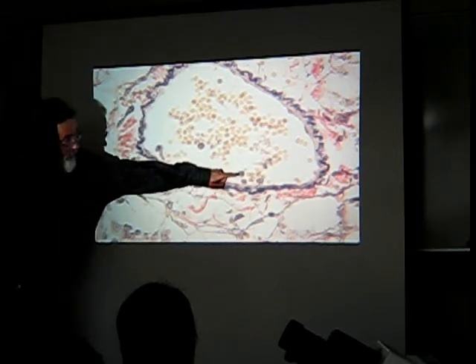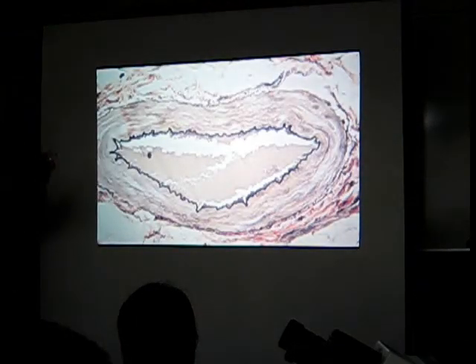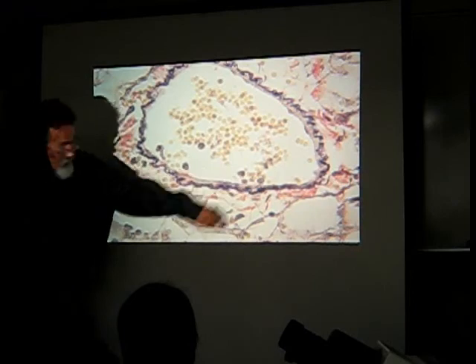What are these? I mean, I'm hearing things that they could be. I don't really know. It's a crappy micrograph. I just say leukocyte, right? Nucleated, clearly. Although macrophage or monocyte would have been a good guess because of the size relative to the red blood cell. That might be a lymphocyte. It's small enough.